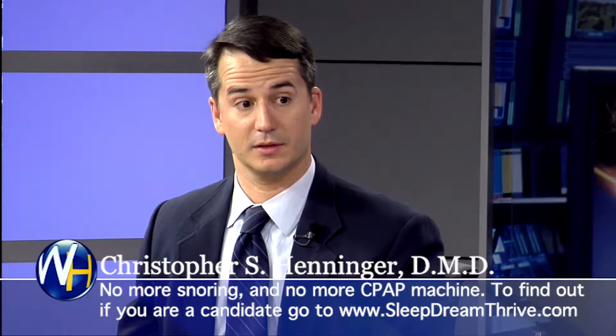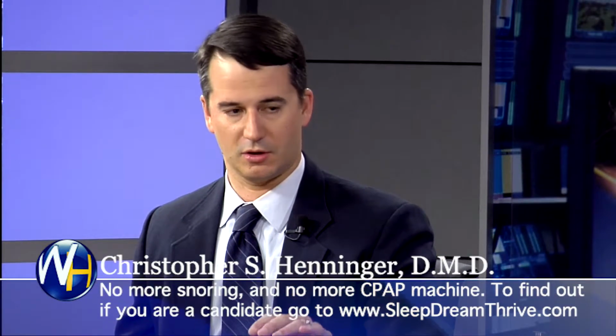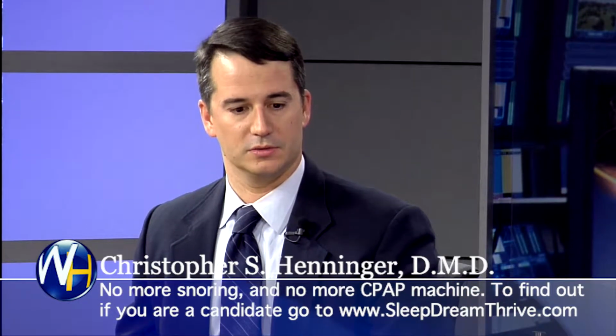And when those muscles relax in the back of your throat, they typically block off your airway. But if we advance your lower jaw, it pulls those muscles forward and they naturally rest in a more advanced position so that it takes less effort to breathe. So therefore you're less likely to stop breathing. And then we do open your bite just a little bit because, again, this is sort of a theory that we have. If you increase the vertical dimension, or how much your bite is open, they will also allow you to breathe easier.